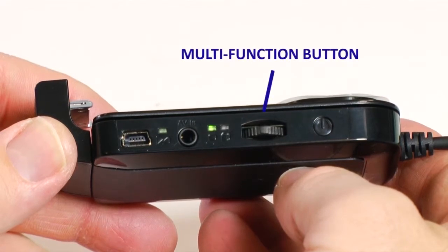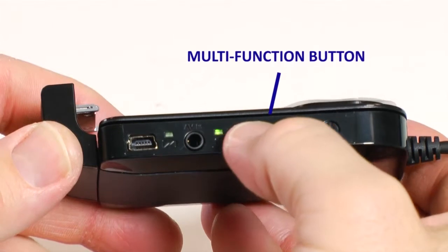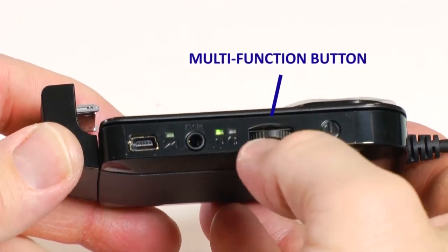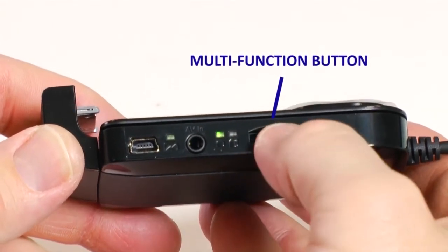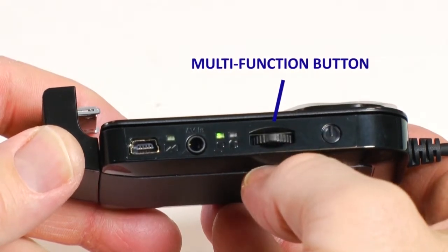The multi-function button controls both the user volume and several on-screen display settings for the Cinemizer. By rotating the wheel toward the cord, the volume will increase. By rotating the wheel away from the cord, the volume will decrease. If a user inadvertently presses the dial, a menu will appear on the Cinemizer screen. This menu will time out after several seconds if no further action is taken.